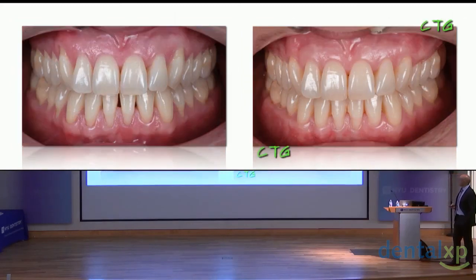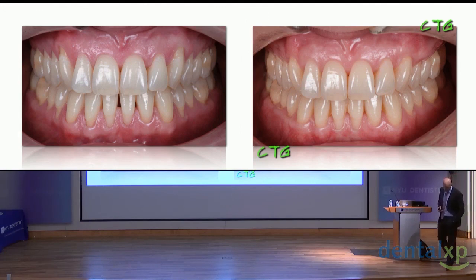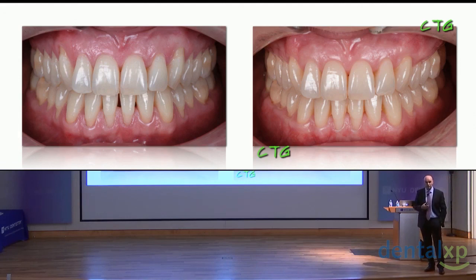So before and after, and once again, you observe that there is a huge difference where we place connective tissue graft, on both sides where we place connective tissue graft. It's not only about covering the recession, in my opinion, it's about improving the biotype.